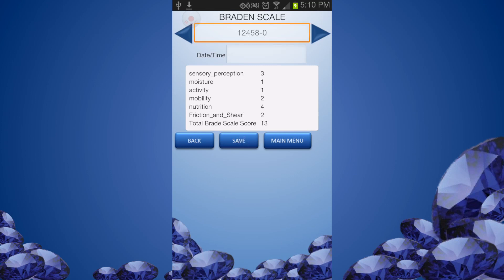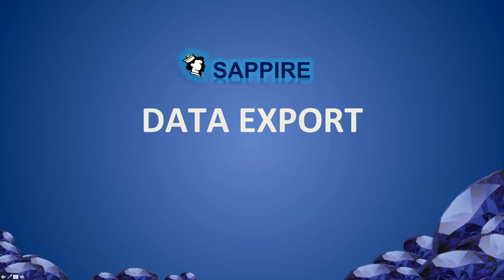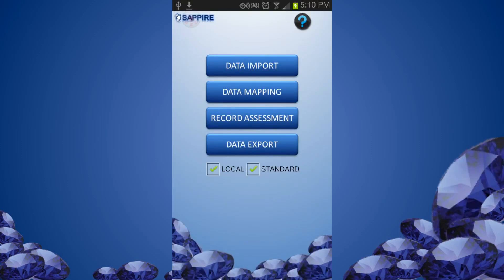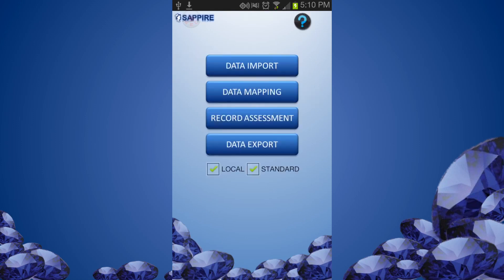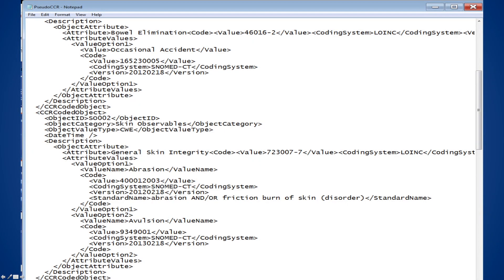Click Save if the scores are all correct. When you finish the assessment and documentation, you can export the data in CCR format to send off to the EMR system. From the main menu, select Data Export. Select the patient to export the data of.